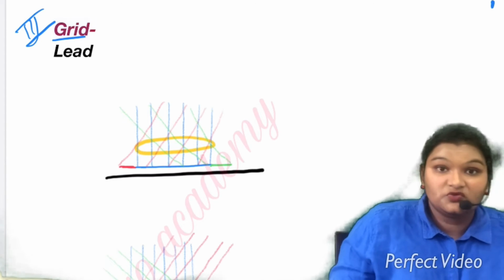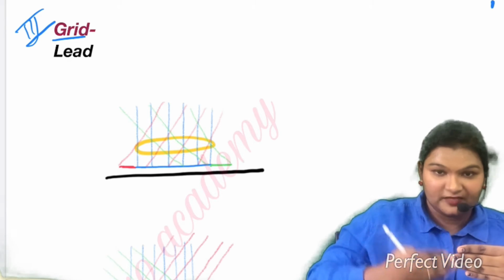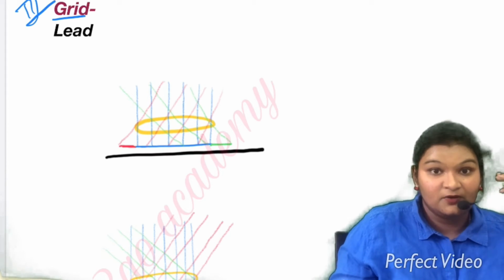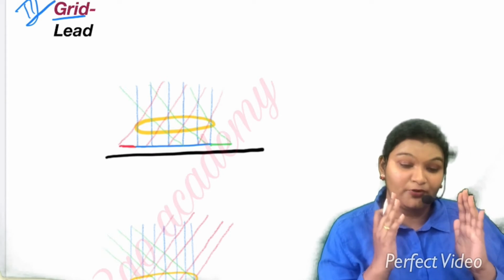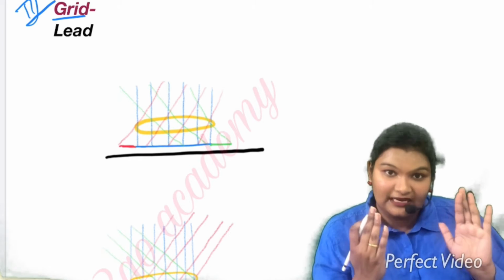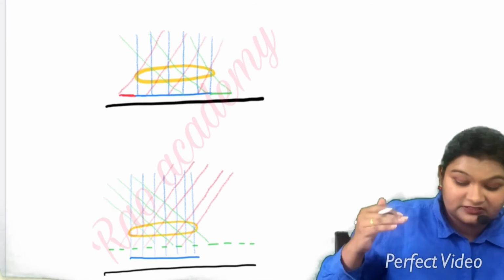Towards the next part in the X-ray tube, that is the grid. So what is the function of the grid? First of all, the grid lies between the patient and the cassette. What does this grid do? It restricts the X-rays which are moving in a particular direction, or which are not in alignment with that grid. So what is the need to block these X-rays?